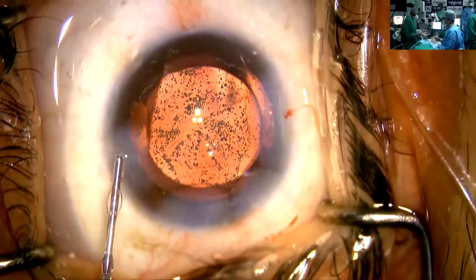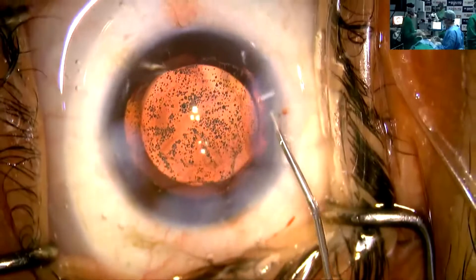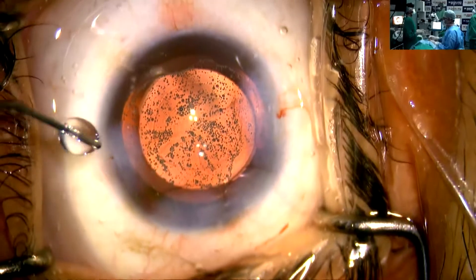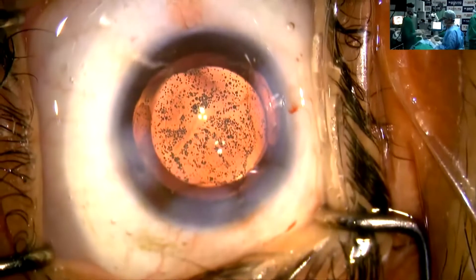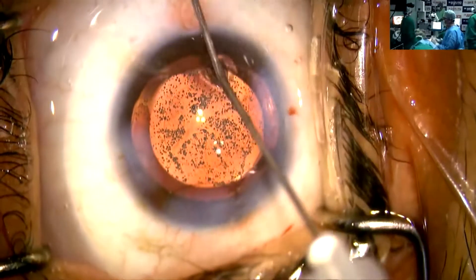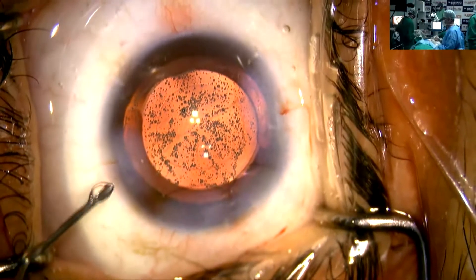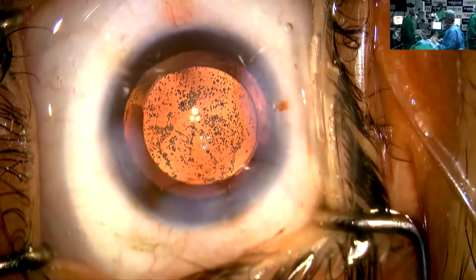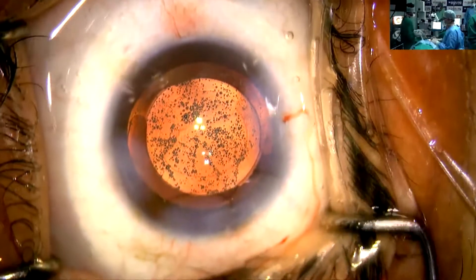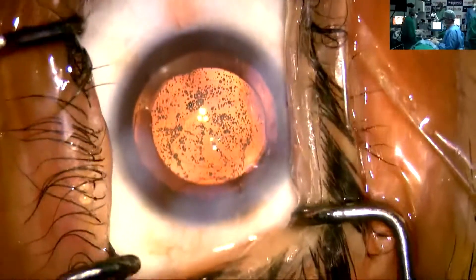Regarding incision size — I made a 2.8 incision. I am more comfortable with a slightly larger incision because I feel the chances of wound leak are much lesser in a slightly bigger wound. So I am not generally in favor of a 2.2 mm incision, even if the company recommends it. But it can go through a 2.2 also. You can see the completion of the surgery — small air bubbles, but that is just part of it. I think the surgery is over.